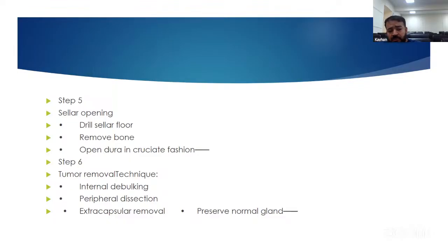But while we are doing the surgery, I remove the lower portion, the dependent portion, and then the upper tumor, which is attached to the upper structure, can be brought down to the lower area, and you can suck it very easily.